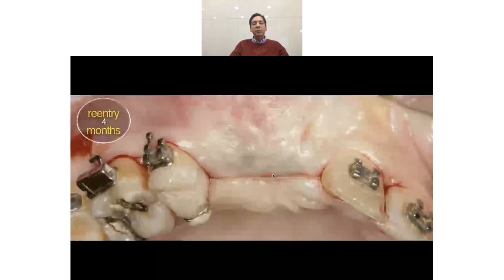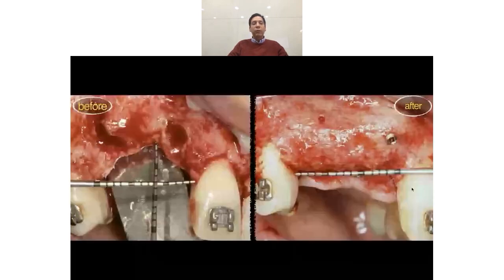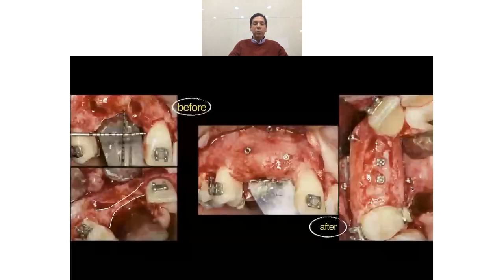And then we raise a flap, a supracrestal incision, and this is what we got 4 months later. This is the regeneration that we can see, vital, bleeding, mature, I can say bright bone, a total three-dimensional bone regeneration. We can see that there is no vertical component anymore. We can see the big buccal bone wall that we have now, and also the cortical block completely integrated in the palatal aspect. So this is the before and the after, 7 millimeters bone regeneration. And here we can see the palatal and buccal bone regeneration, complete three-dimensional bone regeneration in 4 months.